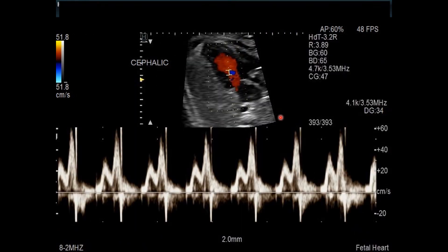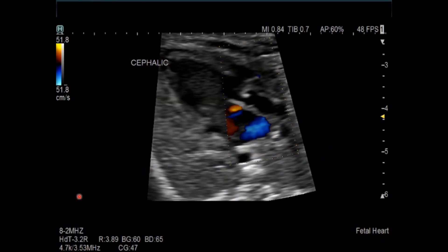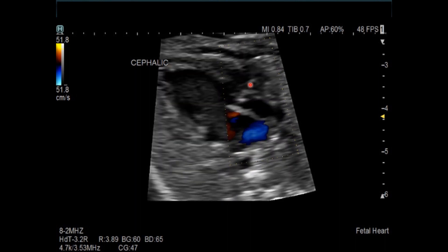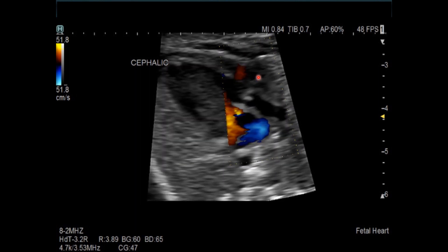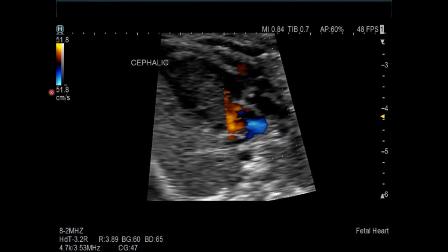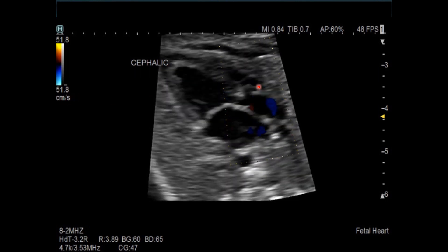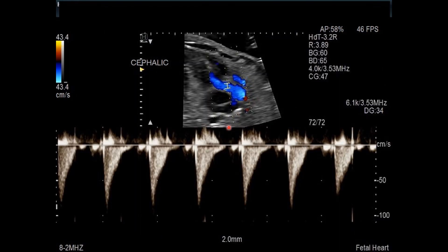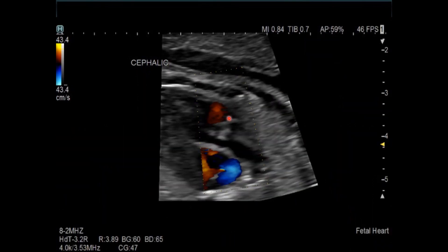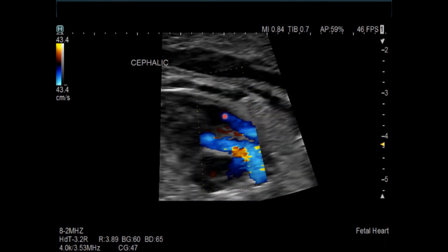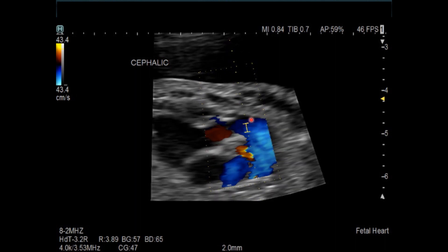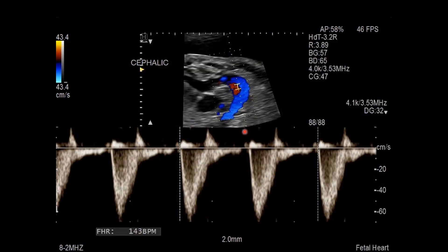Here is the VSD. The mitral valve inflow tracing shows a normal appearing mitral valve inflow with normal velocity. Looking at the VSD to sub-aortic region, the flow is nice and laminar with normal flow velocities. Both outflow tracts look undisturbed based on the color scale Nyquist limit. The subpulmonary or pulmonary valve tracing shows a normal appearing tracing, and the sub-aortic/aortic valve region shows a normal tracing with a heart rate of 143, which is normal for this fetus.